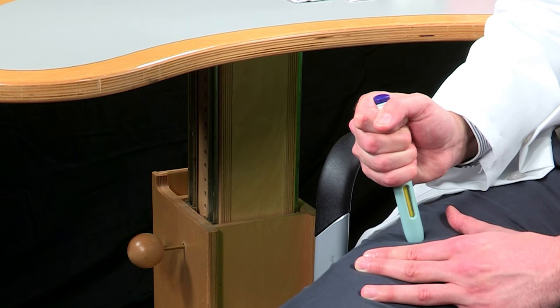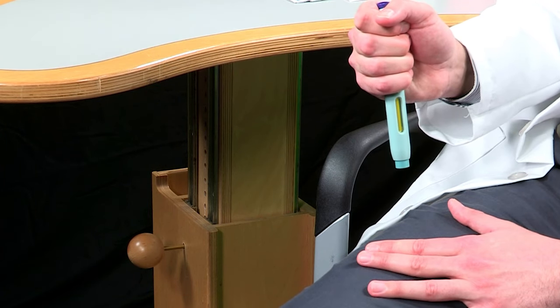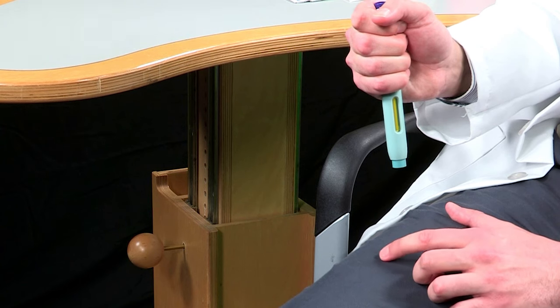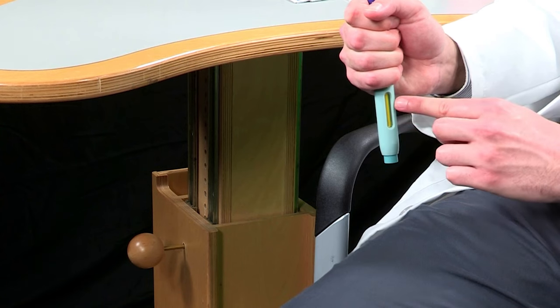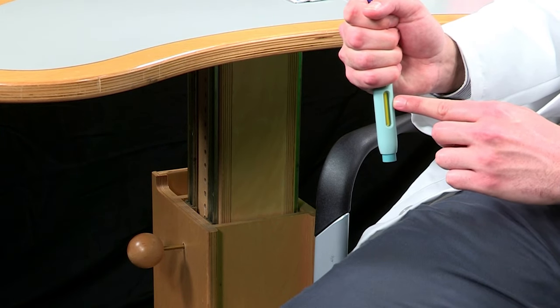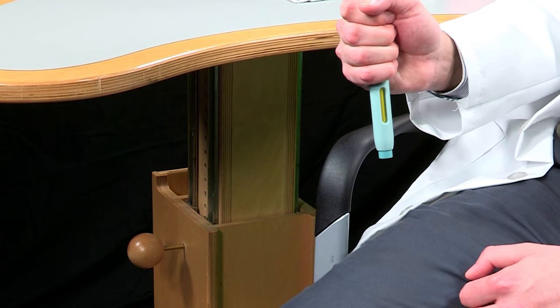After you remove the autoinjector from your skin, the needle will be automatically covered. This is important. When you remove the autoinjector, if the window has not turned yellow or if it looks like the medicine is still injecting, this means you have not received a full dose. Call your healthcare provider.